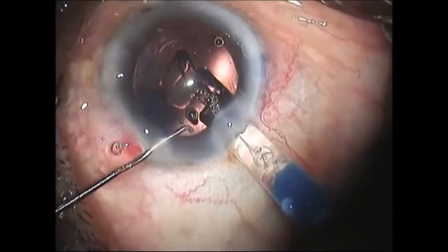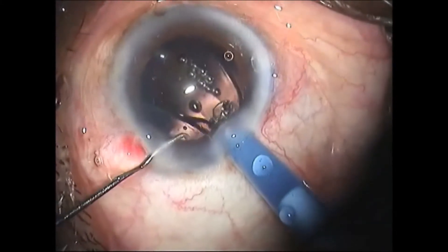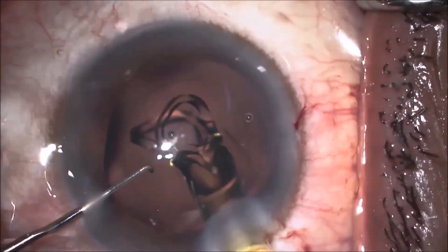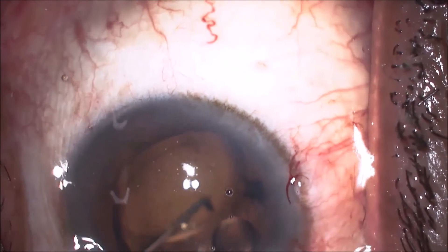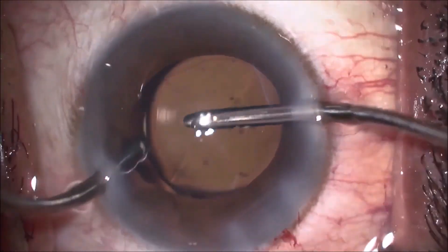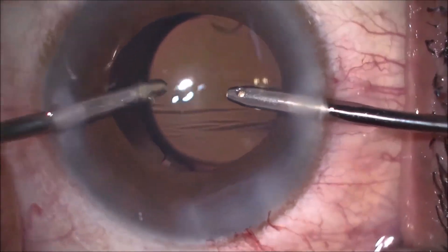Once we have managed all the nuclear and cortical issues, the choice of IOL is for the surgeon to decide — it can be a single-piece foldable, a trifocal, a toric, or even a multifocal. But make sure the viscoelastic under the lens is washed out completely.